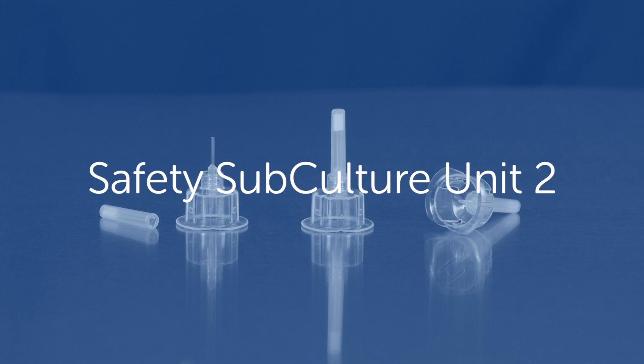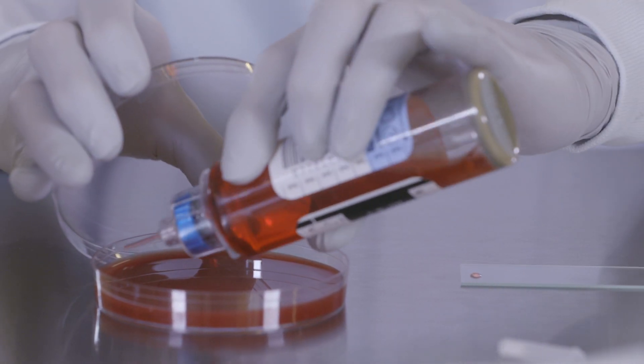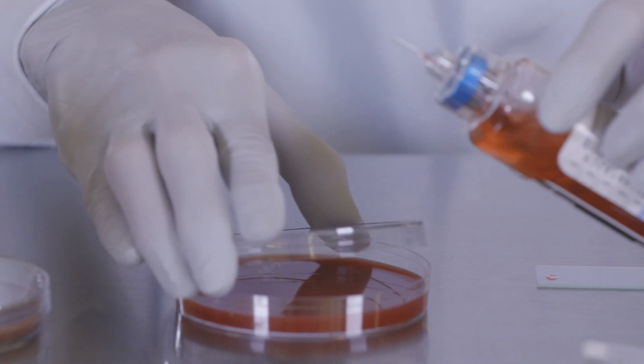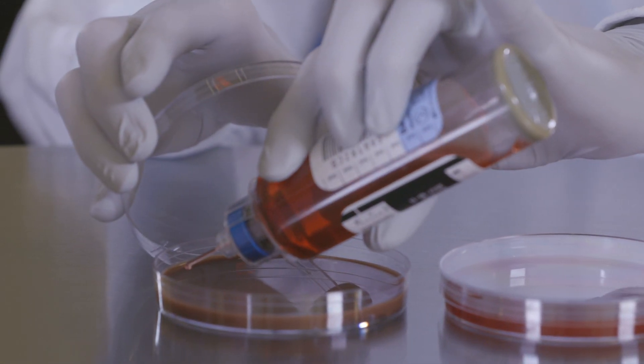The ITL Safety Subculture Unit 2, referred to in this video as the SCU-2, is a needleless device used to safely dispense sample from blood culture bottles. It replaces other commonly used devices such as venting needles or needles and syringes which have inherent potential risks for needle stick injuries.